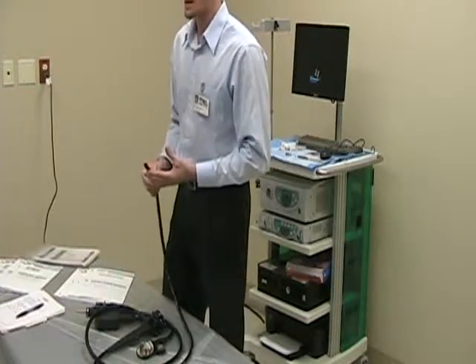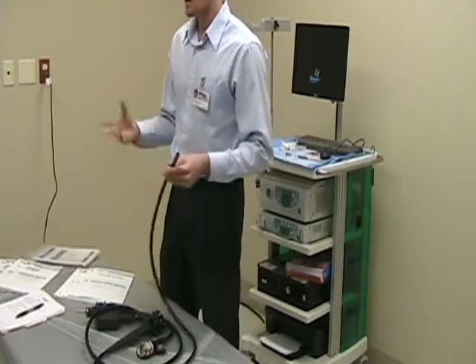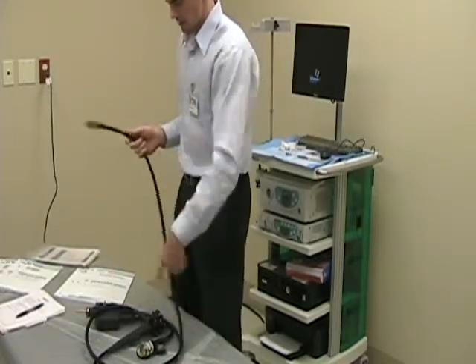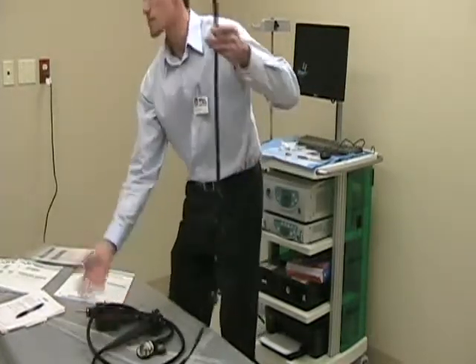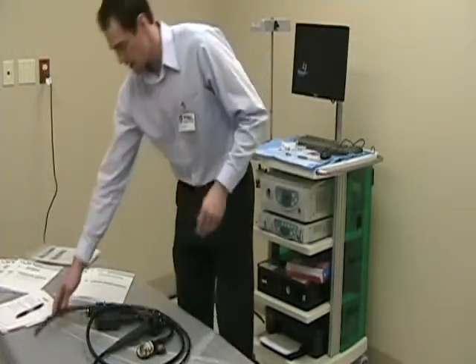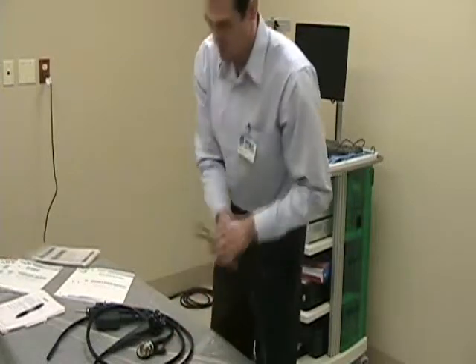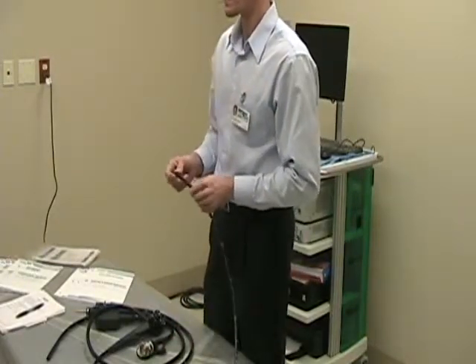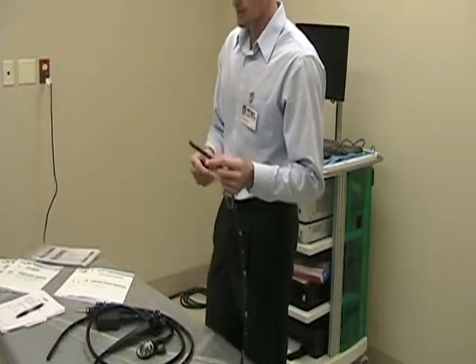Pretty much everything will fit down it. 10 French, all your tools, your cautery, your bipolar, whatever probes, okay? But they have to be the 180 centimeters long, of course, to get down through here. So I tell you that because on an EGD, the interior channel is only 2.8. So about 7 French is about the biggest forceps or anything you can get down there.